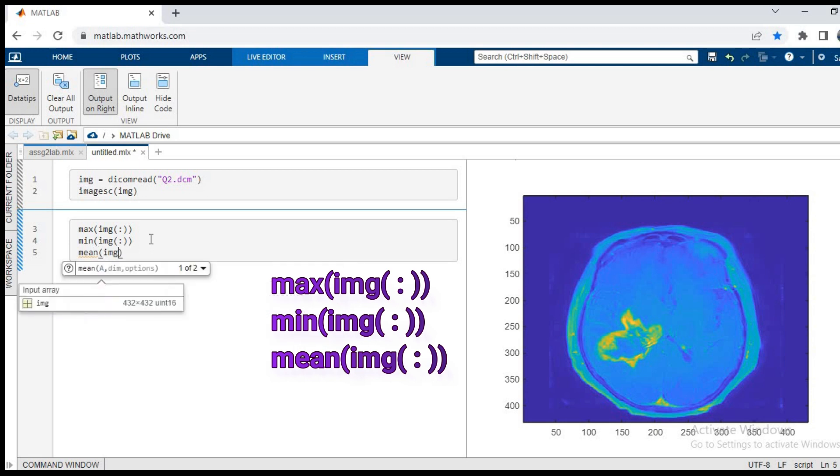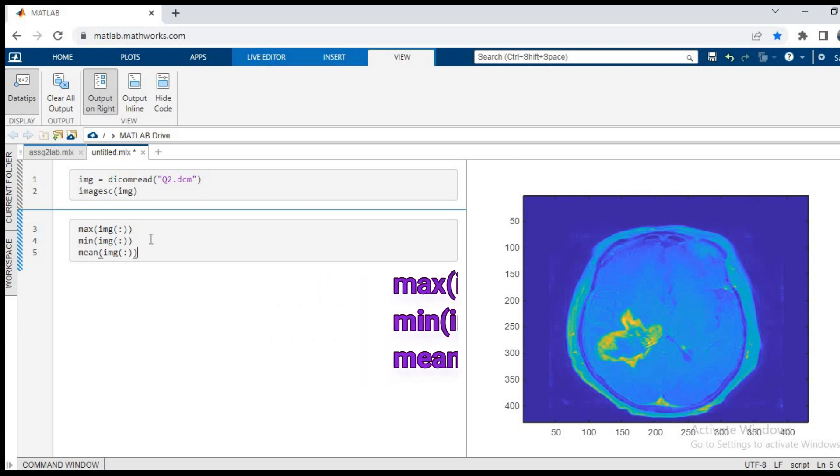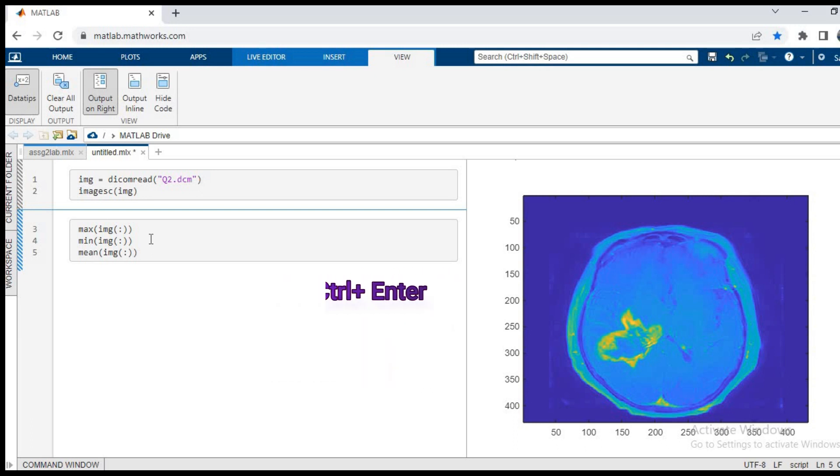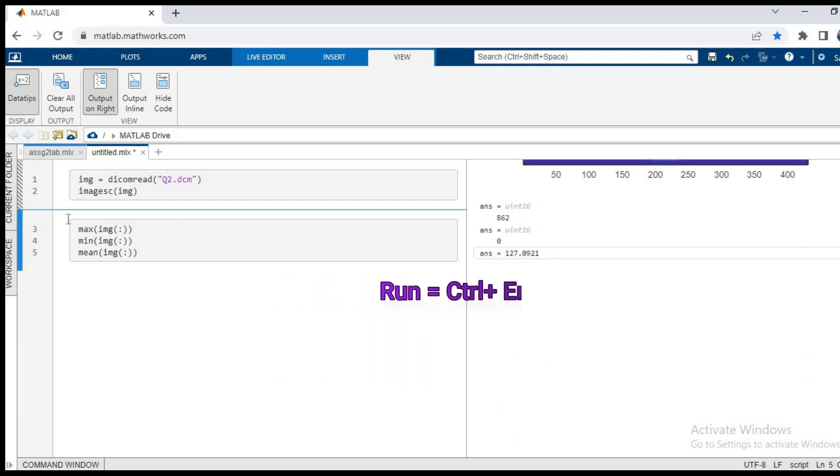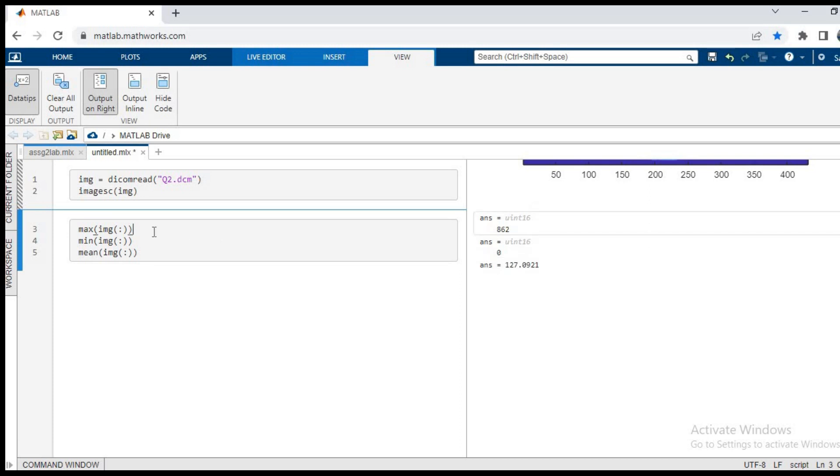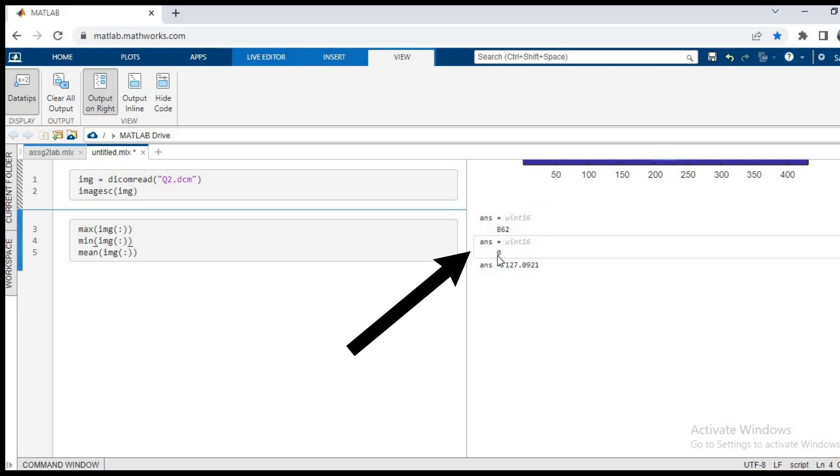We press ctrl enter. As we can see in the output, the max value of the image is 862, that is the highest value. The min value is zero, that is the minimum intensity or the minimum value of intensity of a pixel in the image. The mean value is 127.